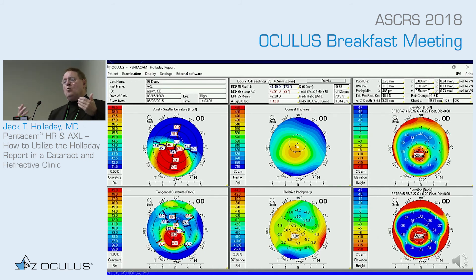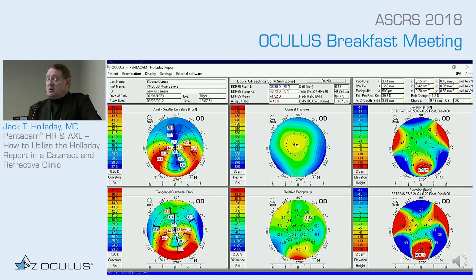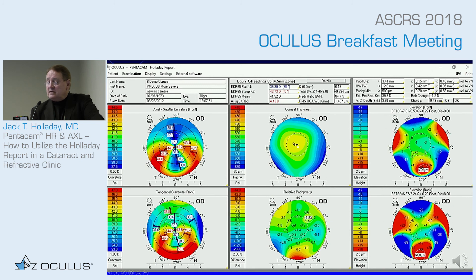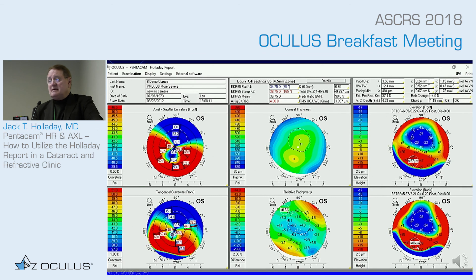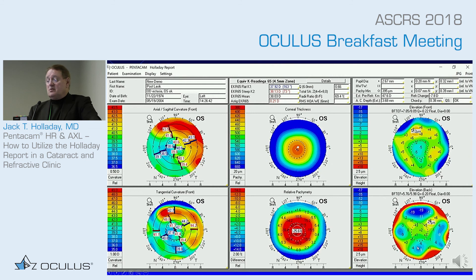Here is pellucid marginal degeneration. The classic sign is the crab-claw pattern on the axial map. This results from the inferior peripheral band of thinning and bulging, visible on the relative pachymetry map as thinning in that zone, with corresponding inferior elevation. You can see a moderate crab claw in one eye and a severe one in the other — you really can't miss those because the crab claw always shows up clearly.